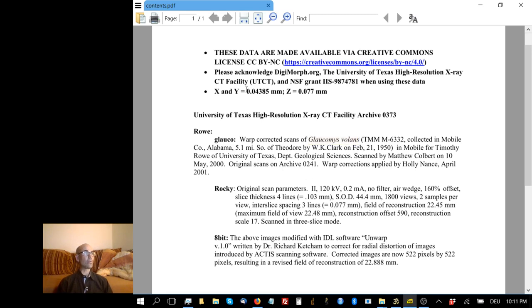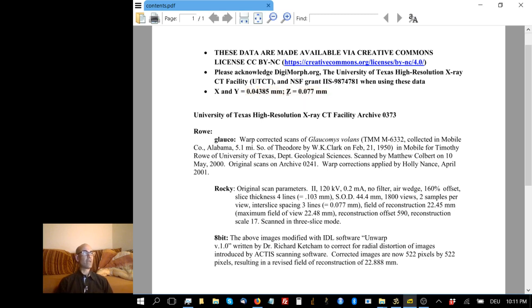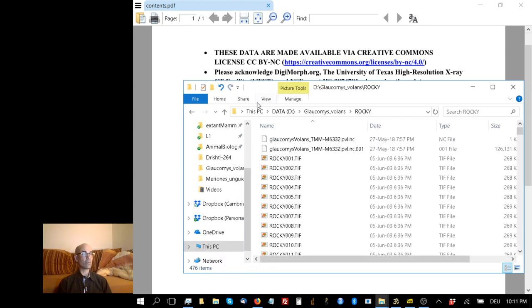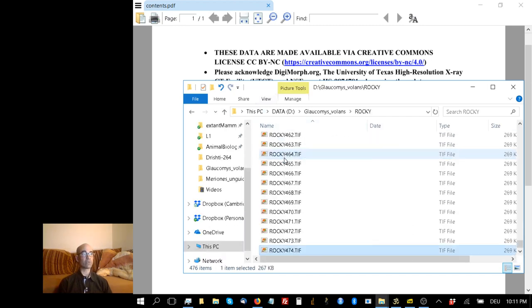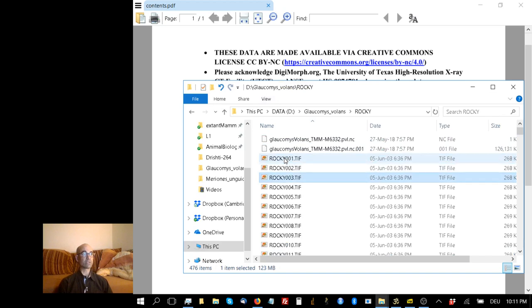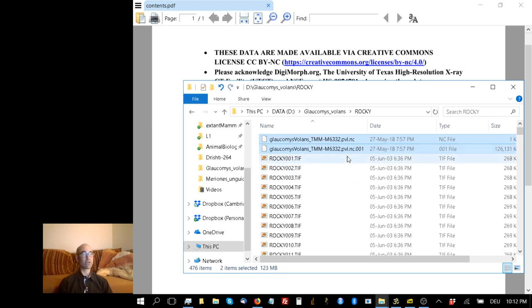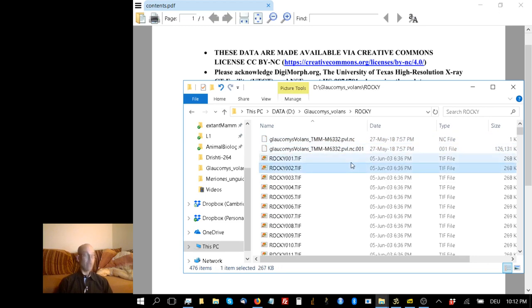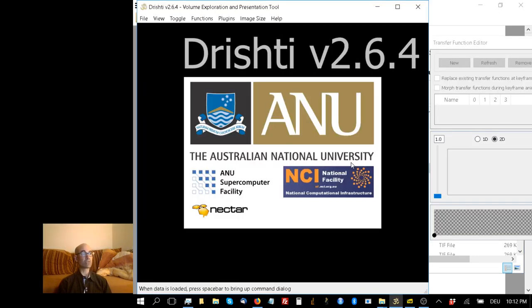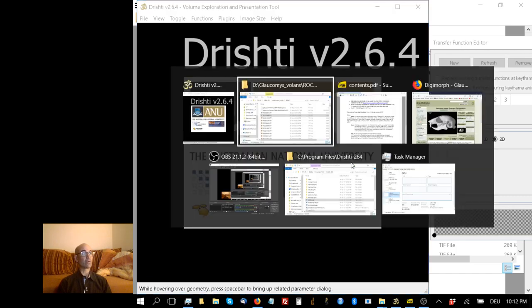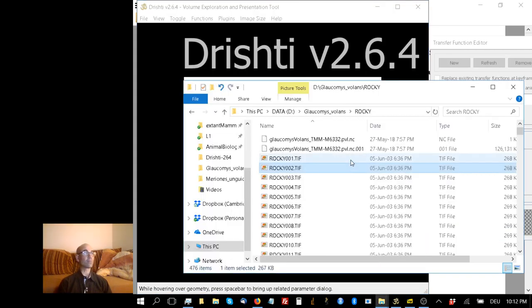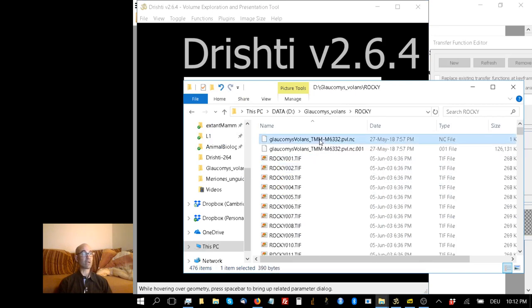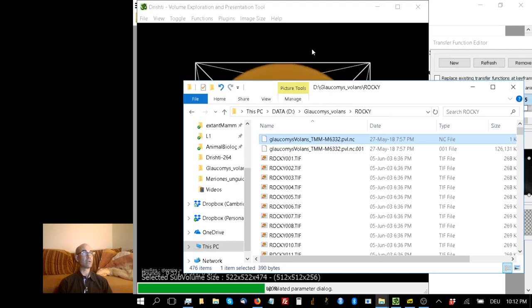We noted before this occasional lack of isometry in the occasional scan. In this case, it's quite substantial - the Z dimension is twice as large as the X and Y. That's going to have an interesting effect that anyone using Drishti should know about. I've already converted the two-dimensional TIFF reconstructions into the volumetric file that Drishti can understand. I'll drag the header file over to Drishti, and it opens right up.